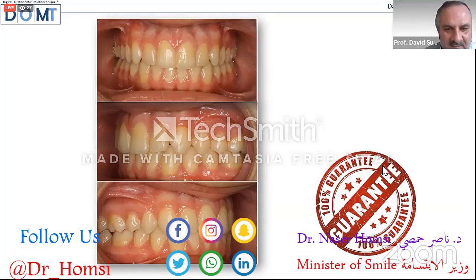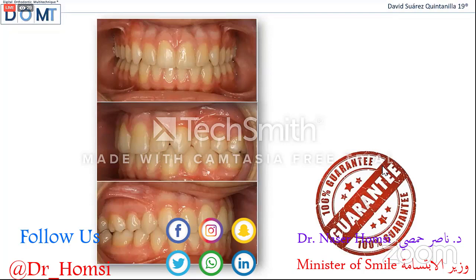Yes. The question is very simple. If you put aligners in children, the first you put aligners with the idea to do all the treatment with the aligner. The big problem is this is very unstable, the aligner, and the kid removes the aligner. But we are talking about putting the aligner only during a very short period, maybe 6 months, 1 year, even less, because it's between the loss of the second temporary molars and the eruption of the upper canine. It's a very short period. In this short period, it's possible to get a very good retention of the liner. Even in my experience with the liner in kids only in this period is very good. I think that we can finish the case with fixed appliances, and that's it. There's no need for aligners with the kids. The kids, they are uncooperative to use a liner. Yeah, we have this problem.